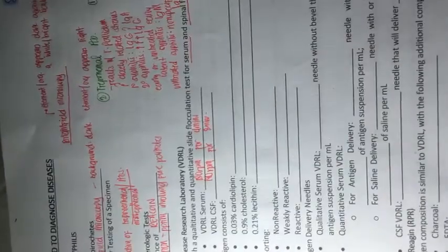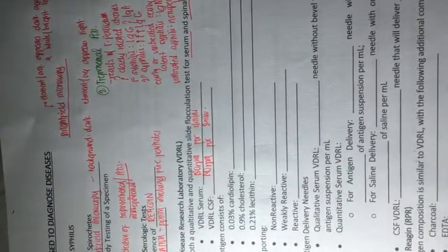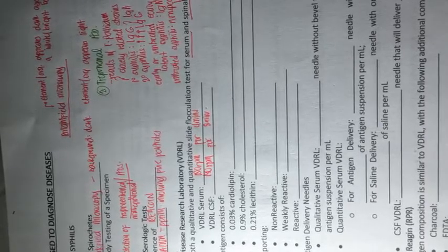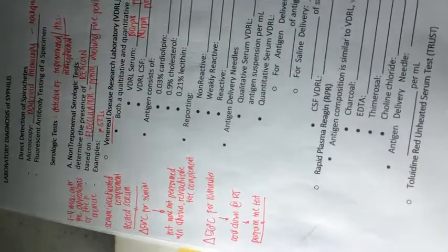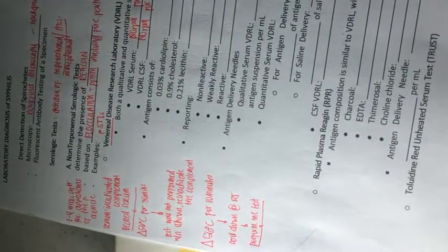Okay, so let's have a brief discussion, or a general idea, on how the VDRL qualitative serum test is performed.